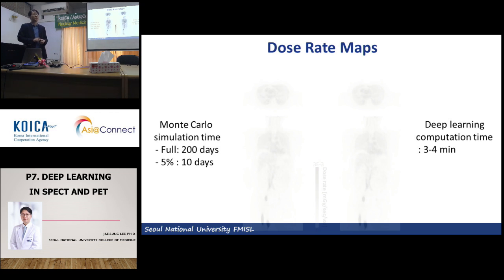Actually, we don't need to calculate S value in the voxel-based dosimetry, because we track every particle, so we don't need to know about the S value between the voxels. The question was because I already know that Professor Jason Lee's group, with the same postdoc when she was a student, published a simple, fast calculation of S values per voxel.